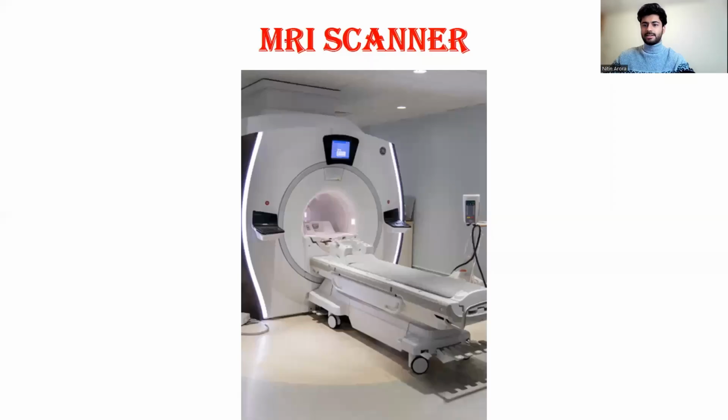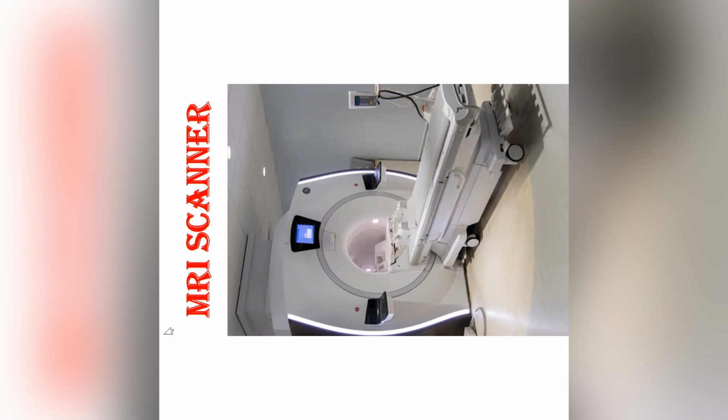For that, I would like to show you certain images, so let me share my screen. Yes. All right, so let me put myself aside on the screen. Over here on the screen, you see an MRI scanner. Those who have not seen an MRI scanner in their life, just see, this is what you call an MRI scanner. On this scanner, you have various parts.